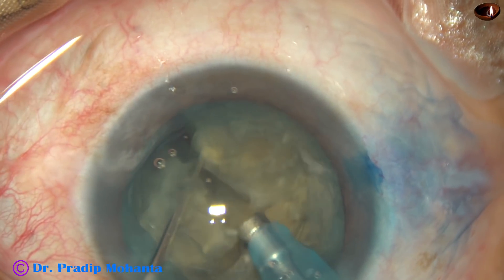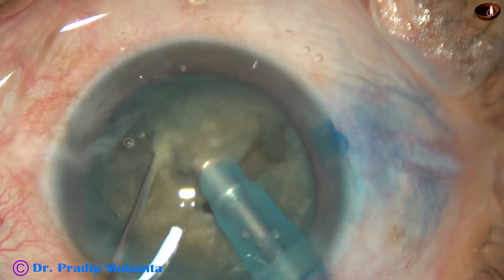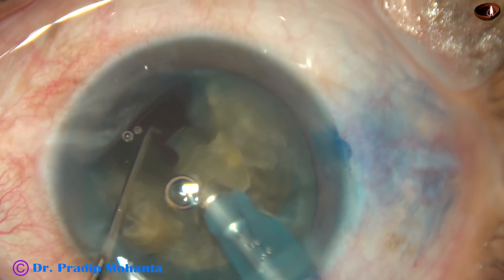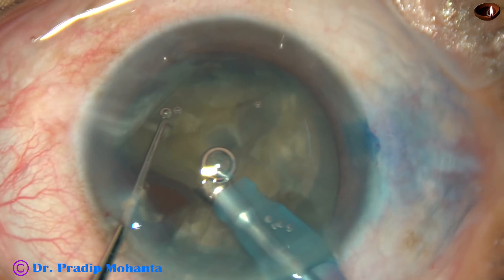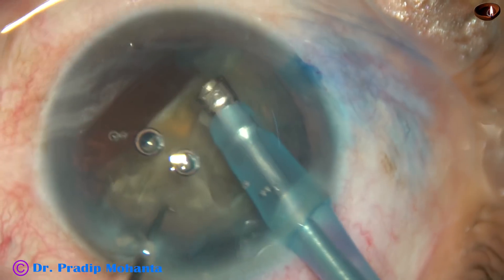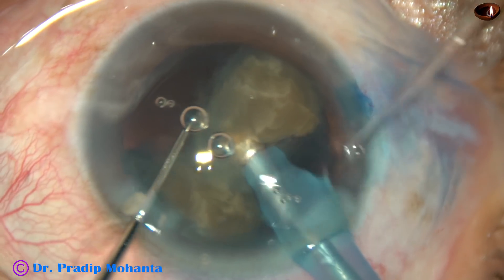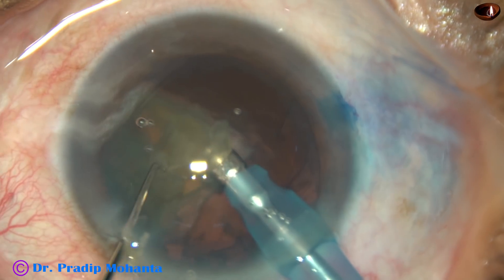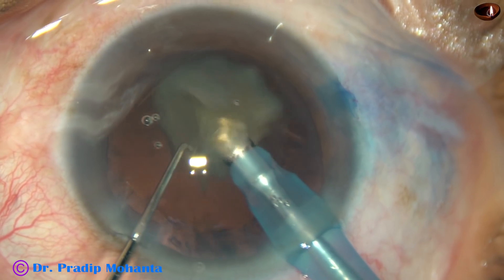Now, each hemi-nucleus is further divided into two parts. This is the other hemi-nucleus — it is also divided into two parts. We can see that the nucleus is quite hard; nucleus sclerosis in this case is grade 4 or grade 4 plus. The fragments are not yet free — just tilt and apply a little energy, and the pieces become free. It is always better to start emulsifying the pieces from their apex. Tilt the fragment and start at the apex.